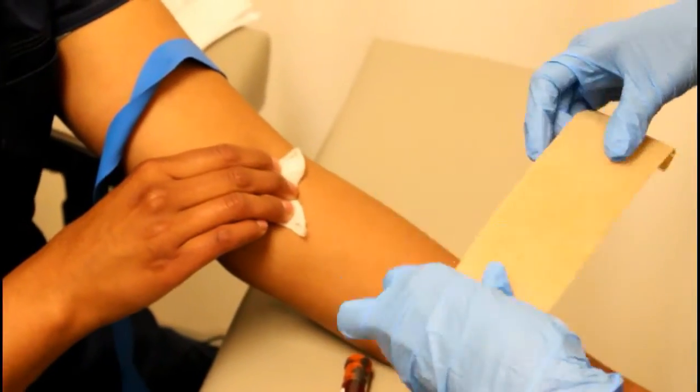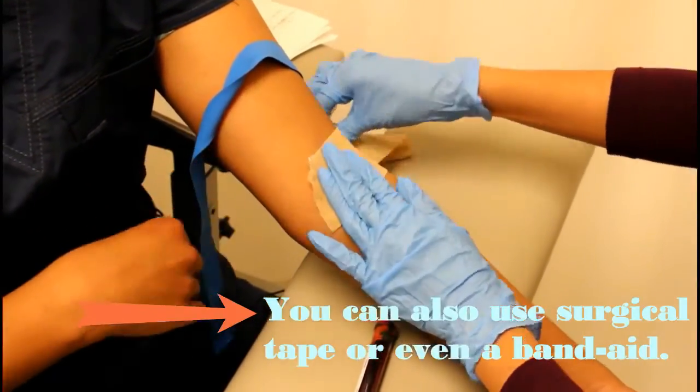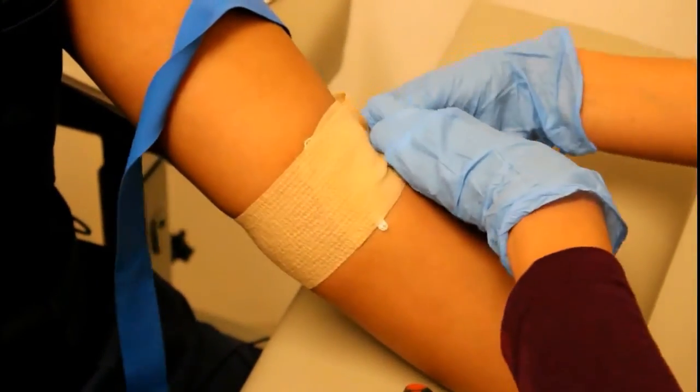Wrap the patient's arm and gauze with Coban. It can be removed after 15 minutes. And after 15 minutes, you can take it off.